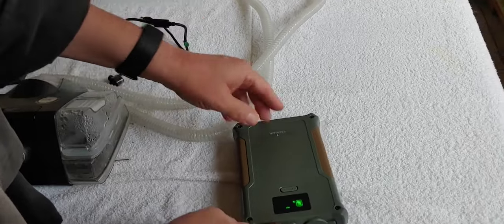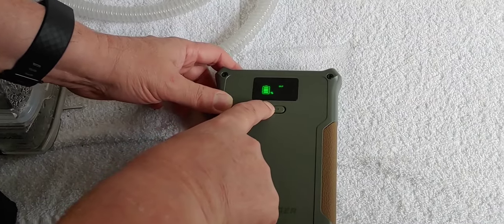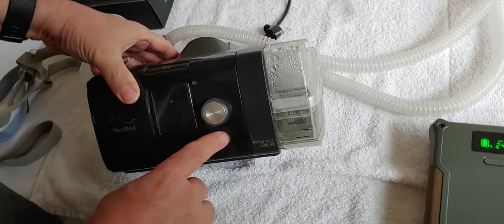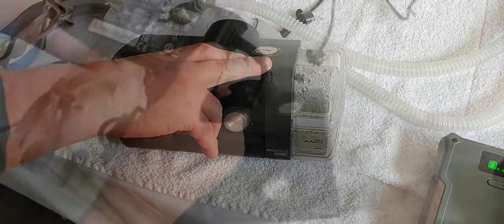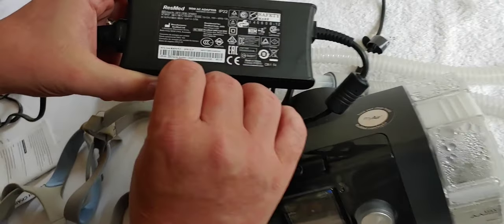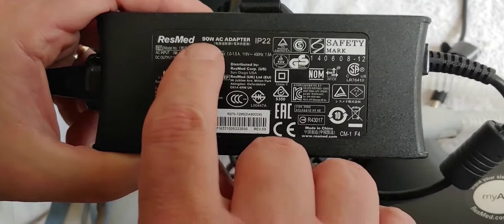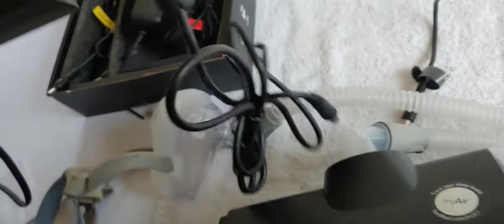What we have to remember is that with these, you have to make sure you have the voltage correct. When you hold the button down, it starts giving you voltages — first 12, then 16.5, then 20. This CPAP machine is 24 volts. How do we know that? One way is to check the manual; the other is you simply get the cord that comes with your device — you can see it shows 24 volt. It also tells you the amps and watts. This is 90 watts, so that's how much you will pull. So we want 24 volts.